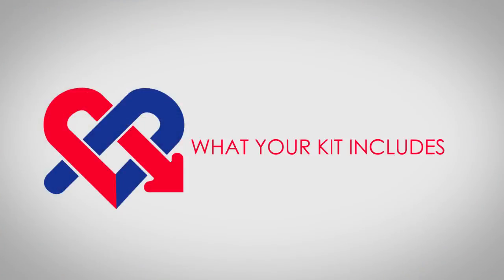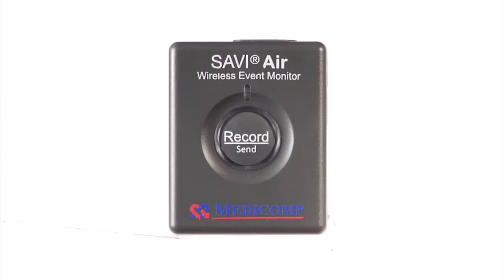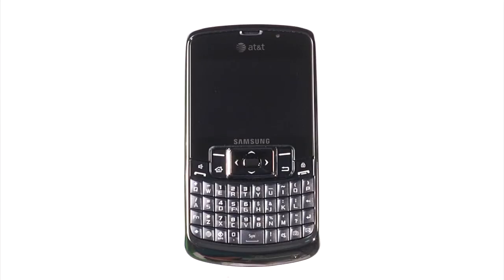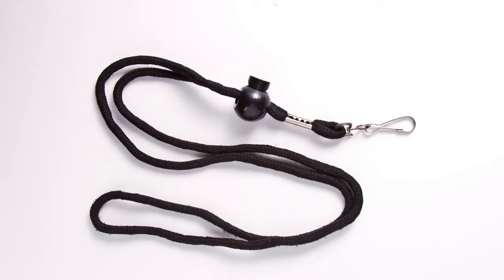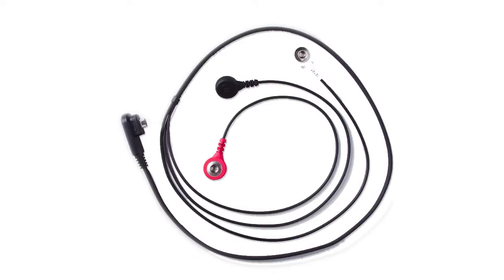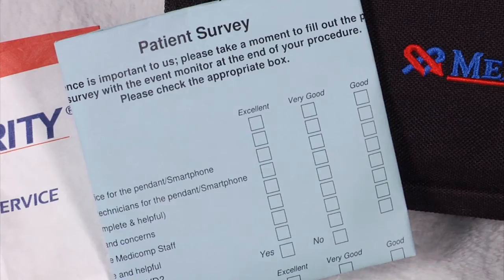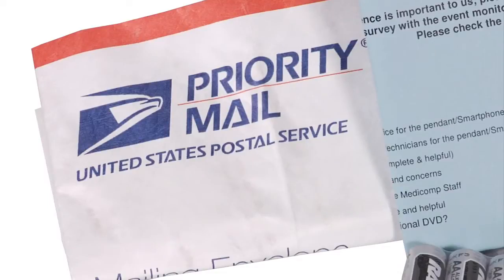What your kit includes. In the kit, you'll find the following items: Savvy Air Pendant, MediComp Smartphone, Pendant Belt Clip, Lanyard, Smartphone Holster, Smartphone Charger, Patient Cable, Electrodes, AA Batteries, Patient Survey, and a prepaid return shipping envelope.